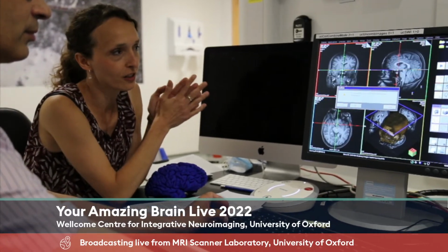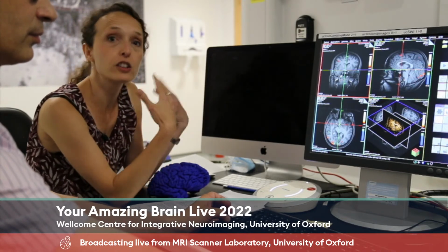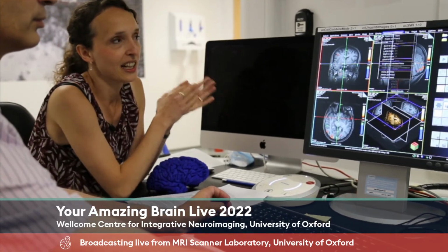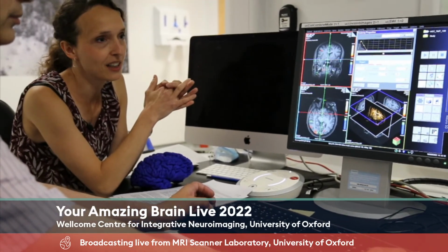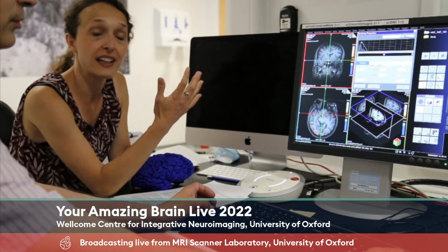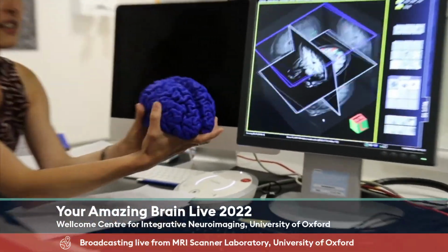That's really hard to look at directly, but what we know is that wherever the brain is active, we need a lot of fresh blood because oxygen is needed. So basically what we're measuring here with our MR scanner today is where the blood flows in the brain. One hypothesis we can already make is that Barbara is looking at pictures. One part of the cortex that cares about looking at pictures is the visual cortex, which takes in all the things that we see with our eyes.